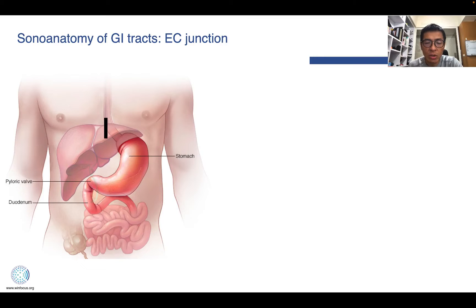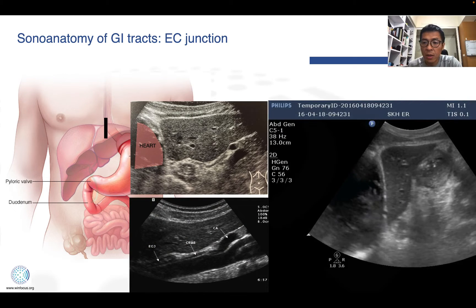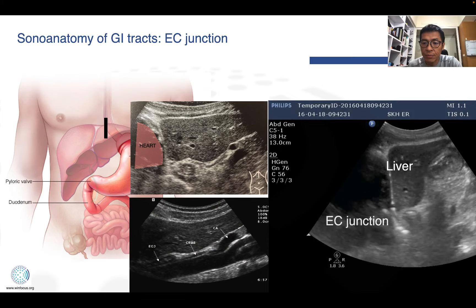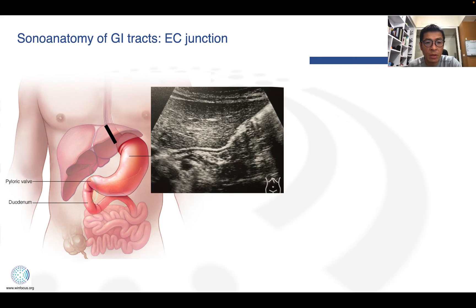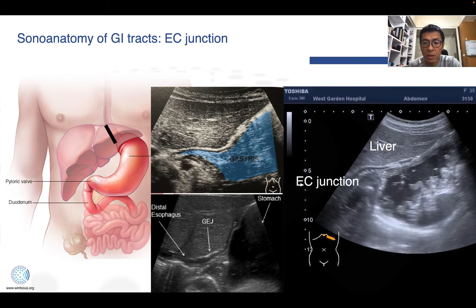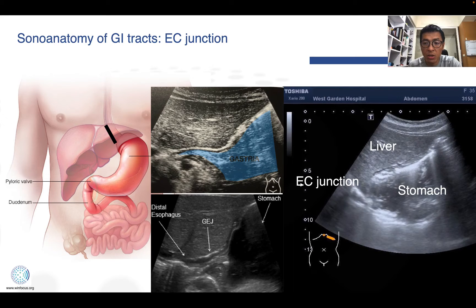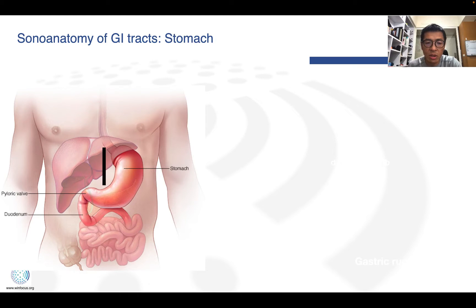Next, we go to the EC junction. Because the thoracic part of the esophagus is difficult to observe from outside the body, we put our transducer over the xiphoid process and use the liver as a window to observe the EC junction. Sometimes we can see the pylorus — tilt the transducer a little bit. We can use the liver as a window to observe the EC junction and stomach, especially when the stomach is distended. It is a good window to observe the stomach.